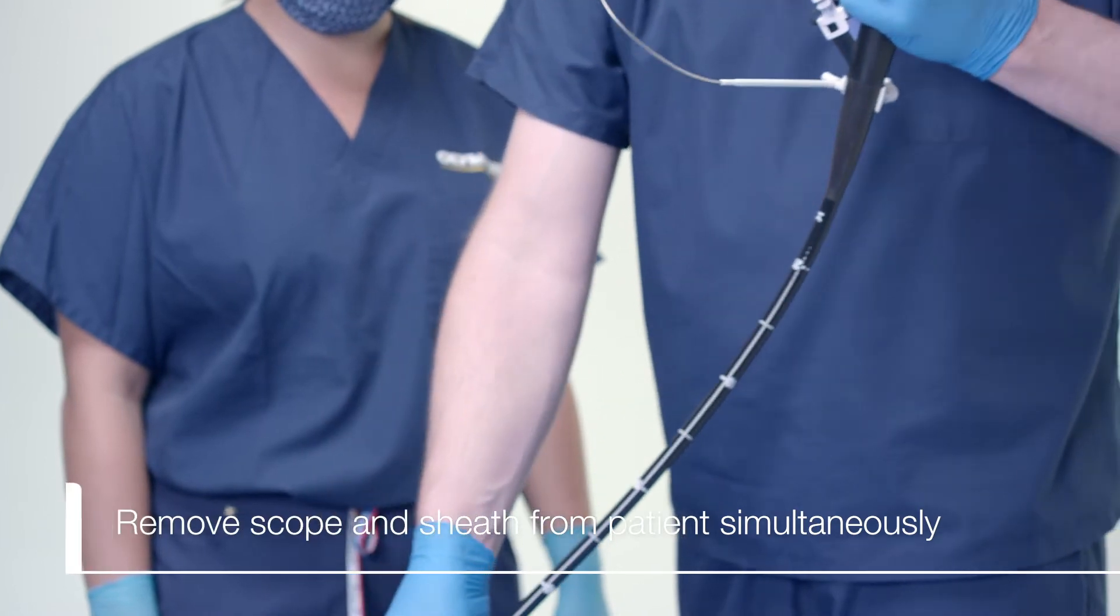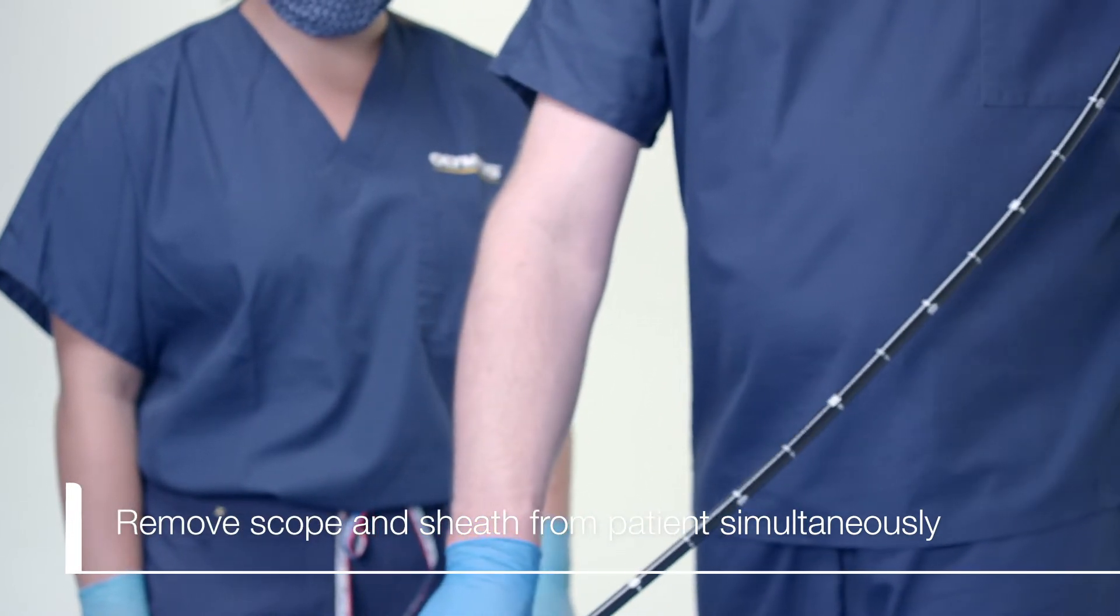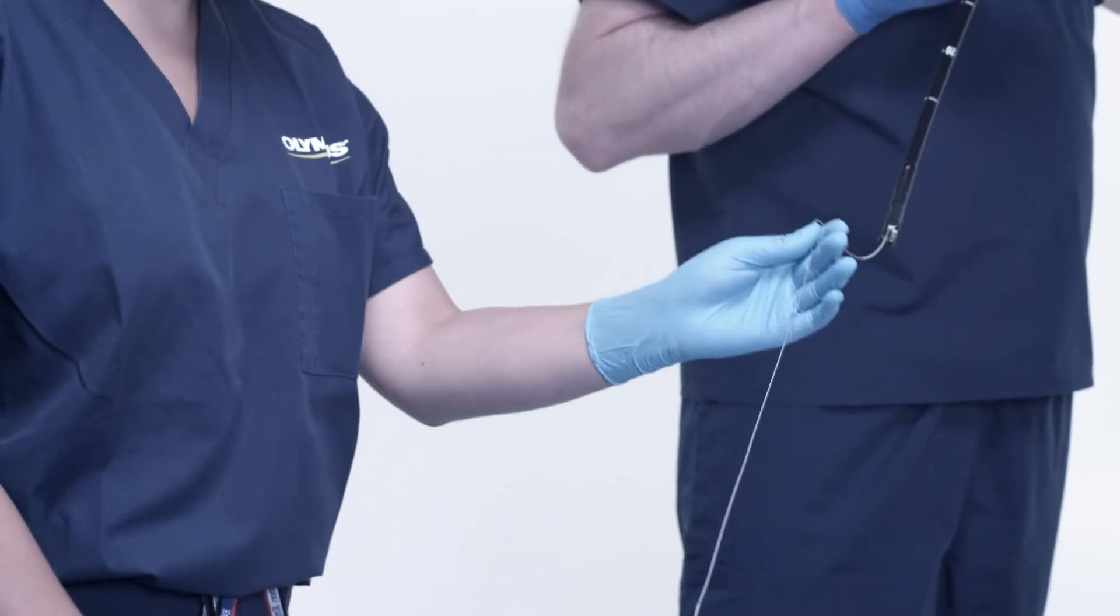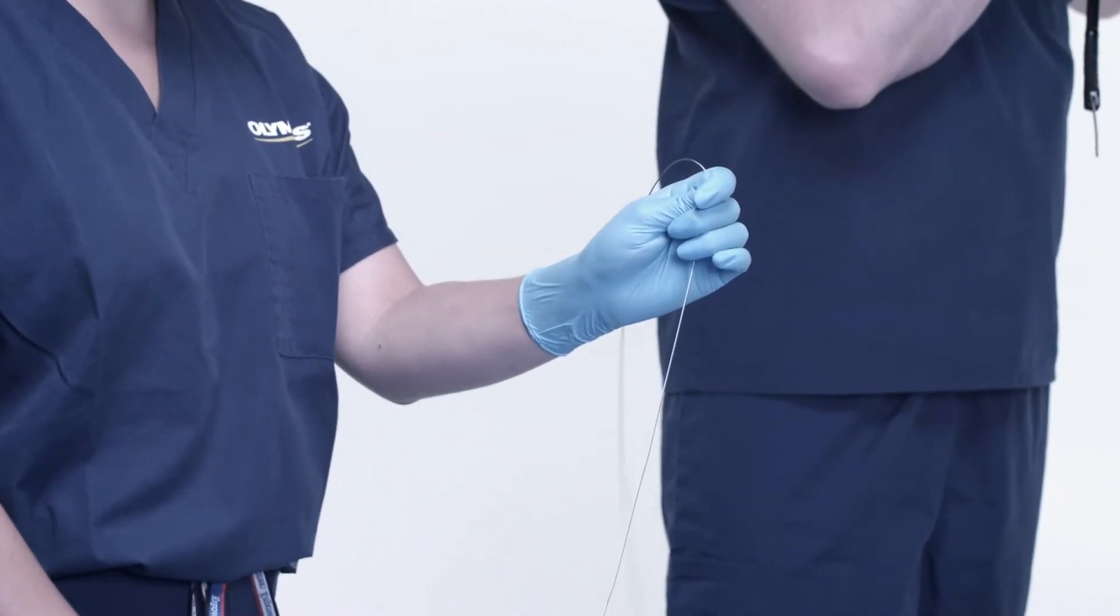Now we must simultaneously remove the VortiCatch V sheath and scope from the patient. Do not remove the sheath prior to removing the scope, as this may cause damage to the scope working channel.